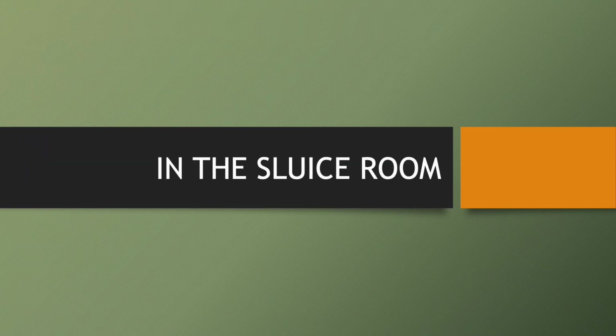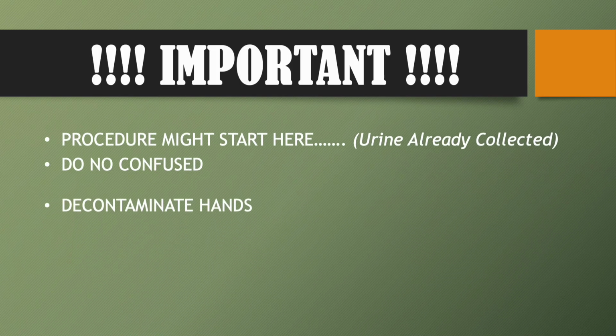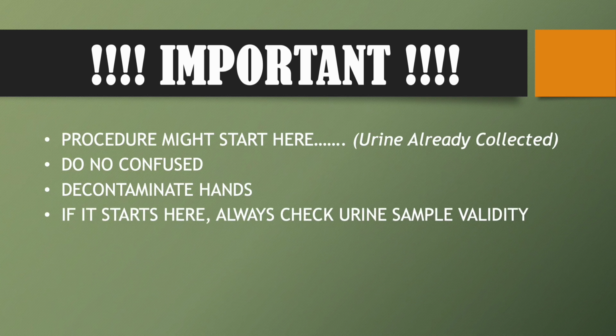Once you've collected your urine, proceed to the sluice room with your urine. Urinalysis is one of the longest procedures. Sometimes because of time, the assessors might say you may start in the sluice room because the urine is already collected. Do not be confused. Decontaminate your hands as always. Make sure that you focus and remember, you are starting at the sluice room, not at the patient's bedside.